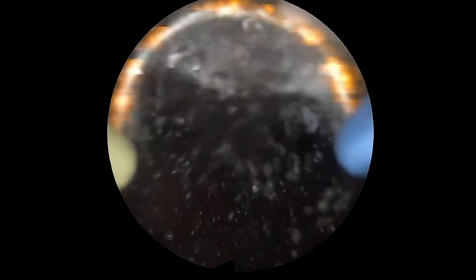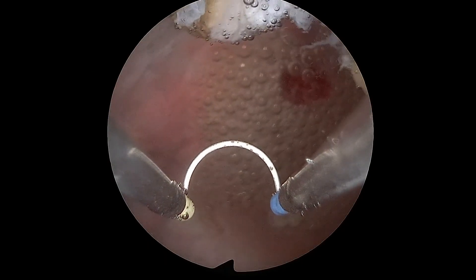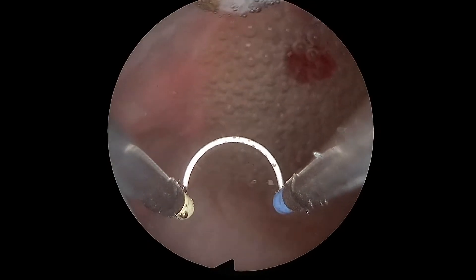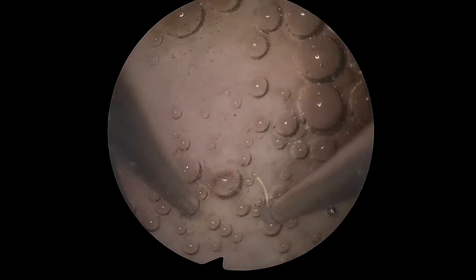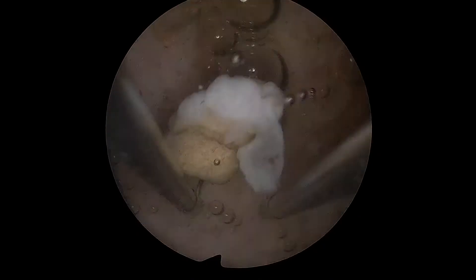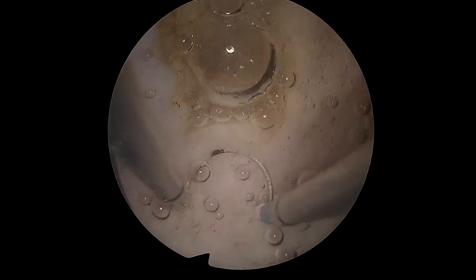These highest fidelity simulation models can be used for training as well as for evaluation. They provide a low-risk, high-stakes environment. As is demonstrated in this sequence, over-aggressive resection of an atrophic endometrium, unfortunately, results in perforation.